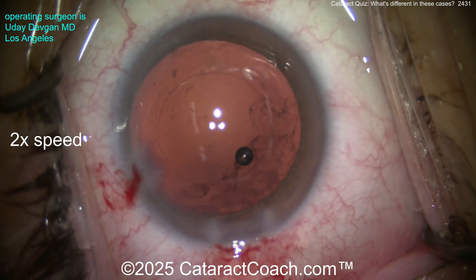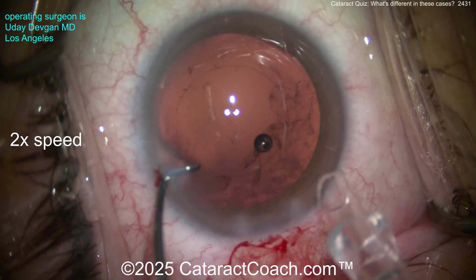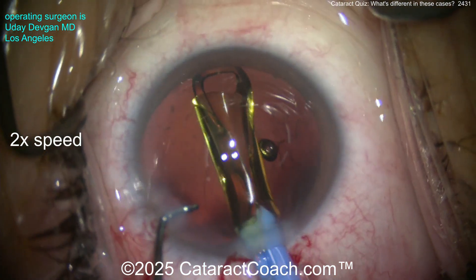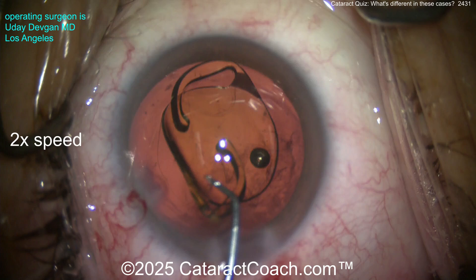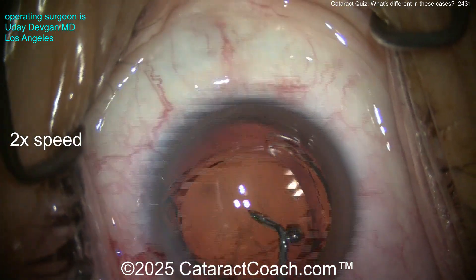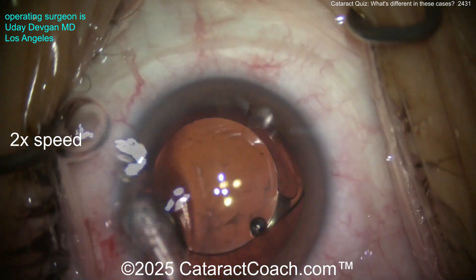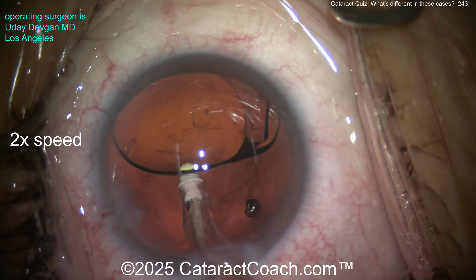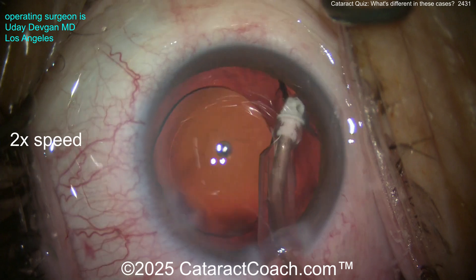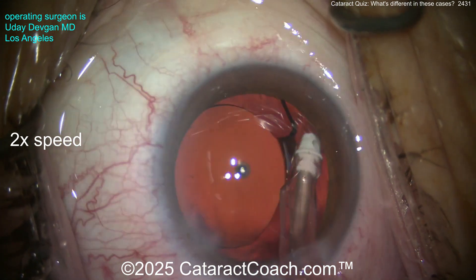Polishing up the capsular bag — this is optional but I like to do it, make sure everything's nice and clean. Let's get the lens in the capsular bag. We're still going to put our single-piece acrylic lens in the bag. Should you put a CTR in? I don't think it's necessary — it's probably less than one clock hour of zonular loss. It's a non-toric lens, so it's rotated to push the haptic toward that section to act as a bolster outward where we had the zonulopathy.